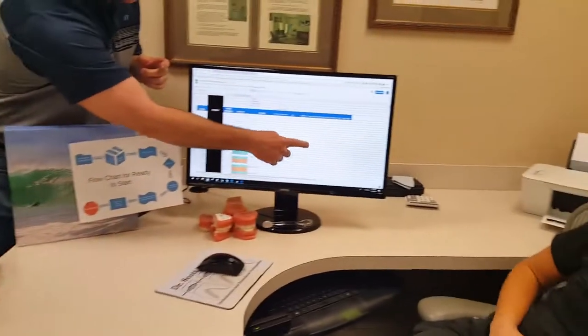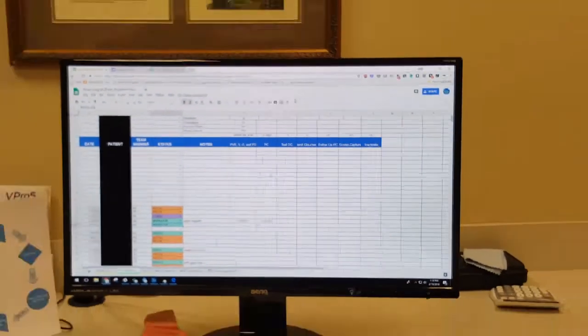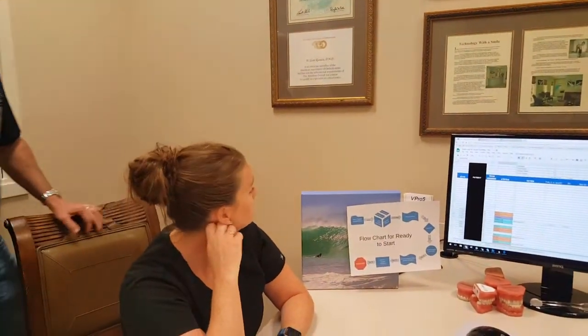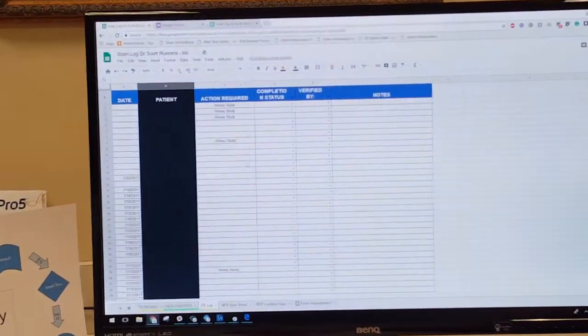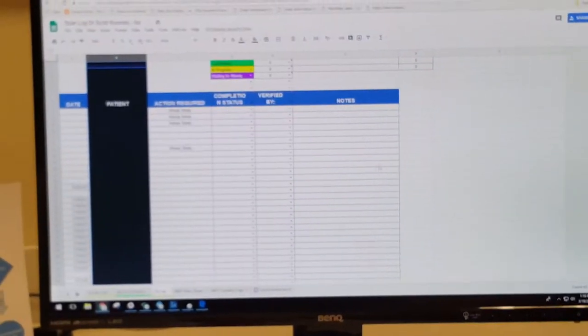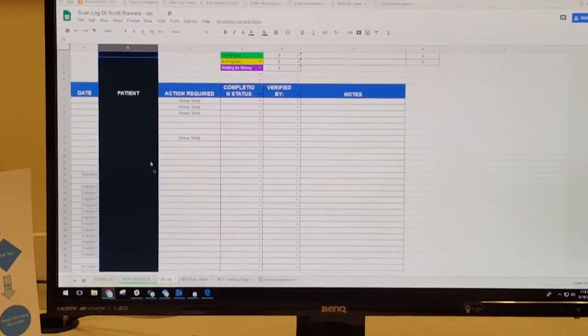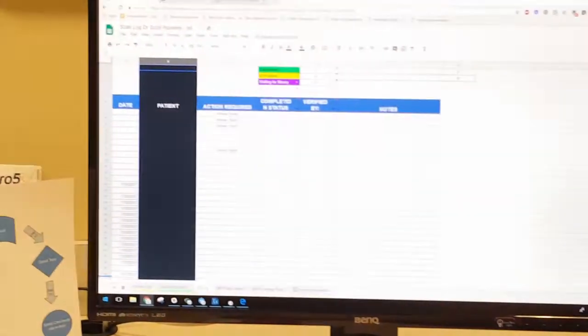They'll date stamp it when each thing is done. So that's the front desk administrator and new patient coordinator that are in and out of that. Then the cone beam log, real quick. Airway studies: we have a cone beam log. As we take the cone beams, we're able to put the names in, and that's a good way for us to track who's going to get sent out for airway studies if we send it off to our team. We can track it.